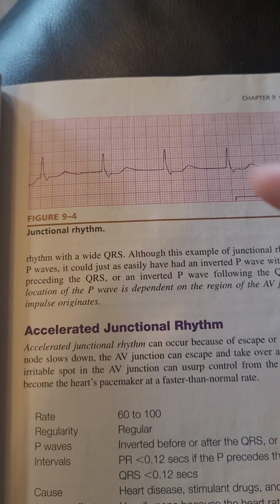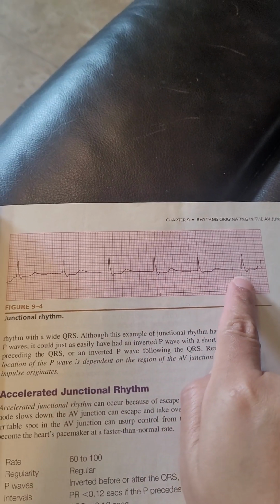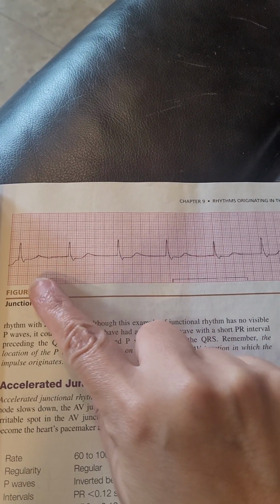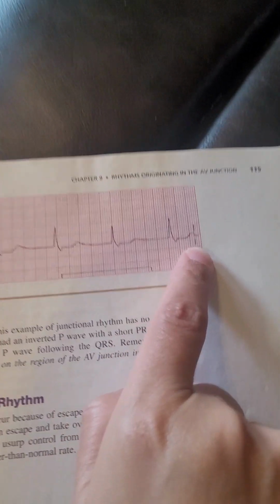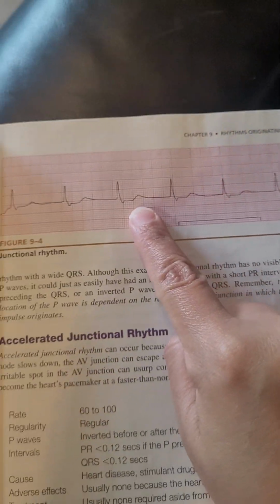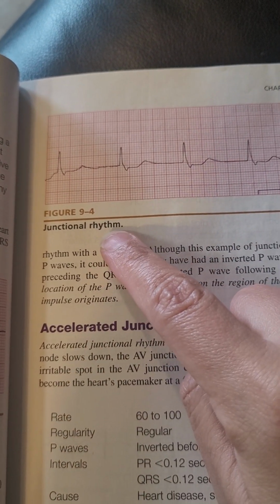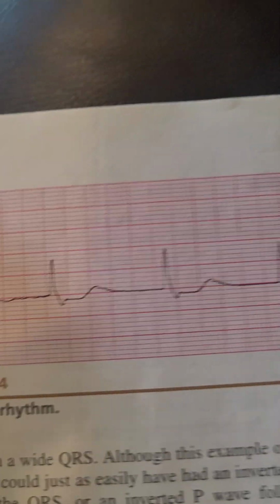This is a junctional rhythm. It's still regular. You can 100% see that it's still marching out. It's still narrow, the QRS is still narrow. 1, 2, 3, 4, 5, 6. You have 6. This is something about the book, you don't pay attention to this. So it's 6, so it's 60 beats per minute. So it's within the range of the regular junctional rhythm. And you don't see a P wave, so most likely this is junctional.